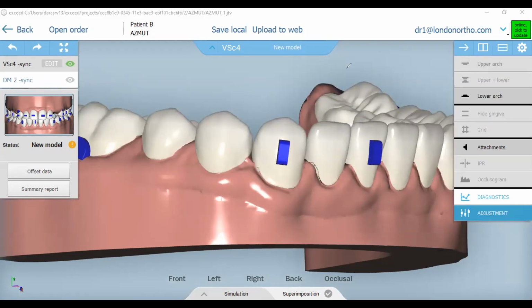Why? Because if you think about it, what am I doing with the plastic? I'm simply pushing those teeth in. So this plastic is going to pop out posteriorly, because I'm applying a force that is going in. Then that aligner will just pop out. And this is simple to understand: you grab a ruler, apply pressure on one end of the ruler, and you're going to see how the other end pops up or elevates.